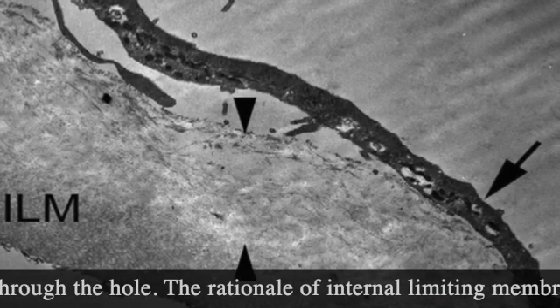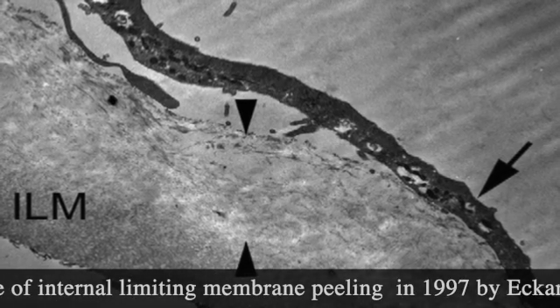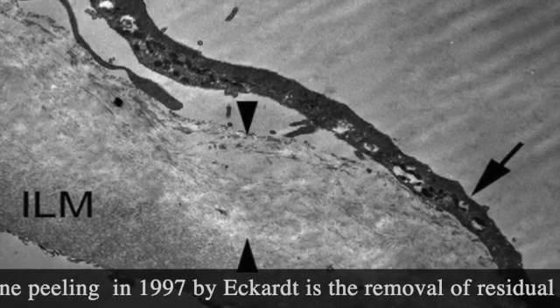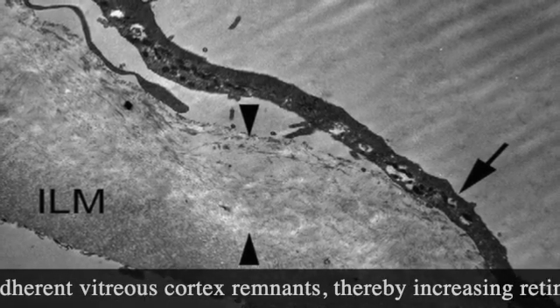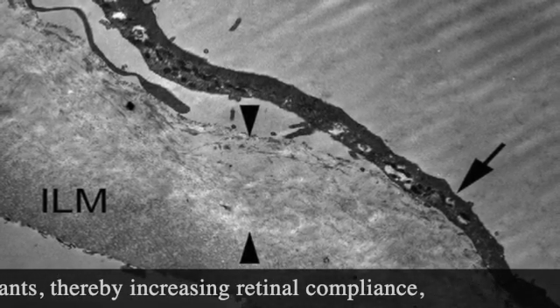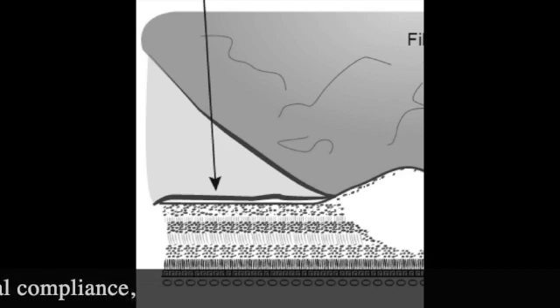The rationale of internal limiting membrane peeling, introduced in 1997 by Eckardt, is the removal of residual adherent vitreous cortex remnants, thereby increasing retinal compliance.